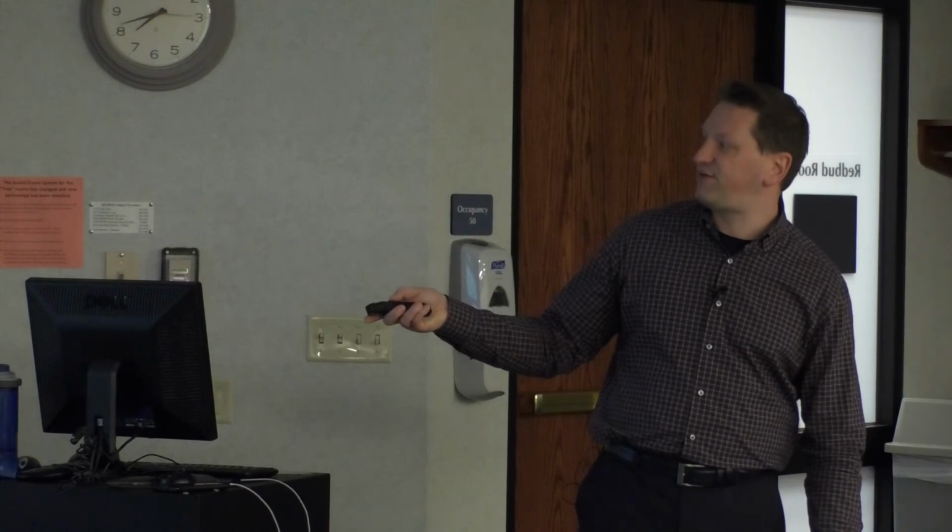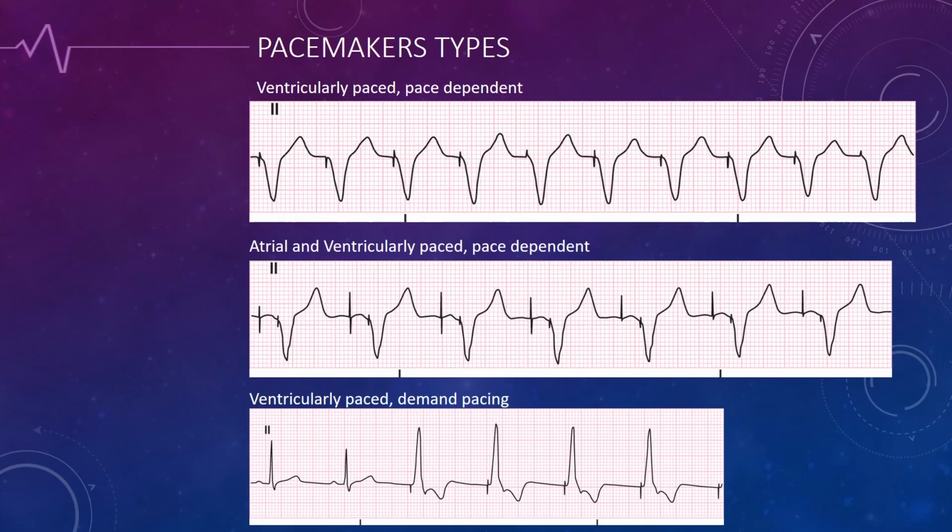If it's really, really big, like as big as the QRS, that's real. And it comes from what's called a unipolar pacemaker. But if you see these weird little spiky things, that may just be artifact if it's a really noisy EKG, okay? So anyway, you see big spikes, look for it to be consistent. You see how these spikes are in front of every single QRS? It's not like just on this one. If you see those spikes on every QRS that looks the same as the one with the spike, it's paced. Is that fair? All right, we're going to keep moving.